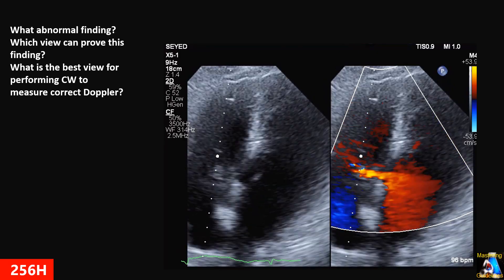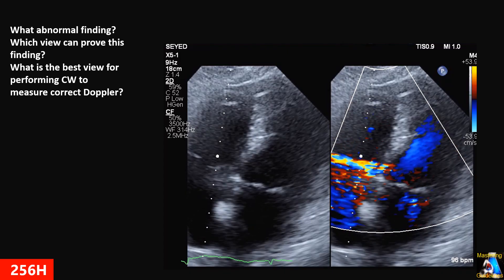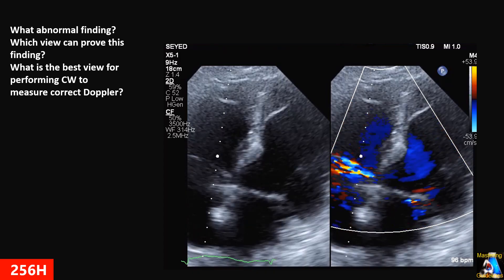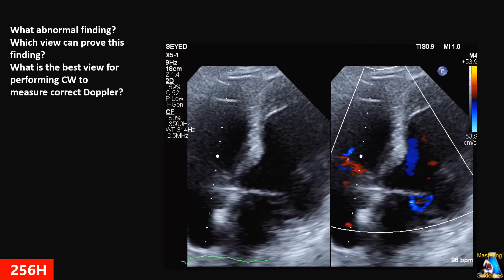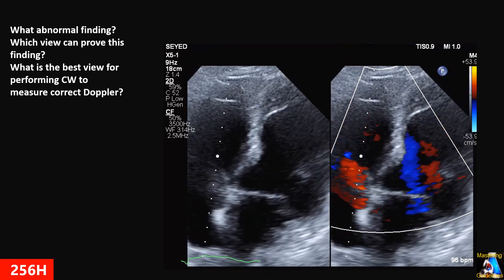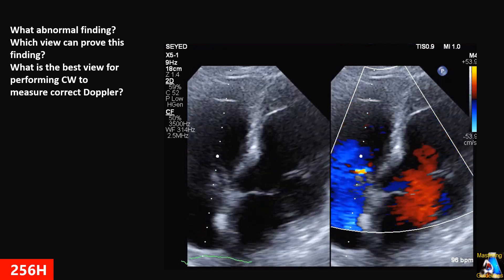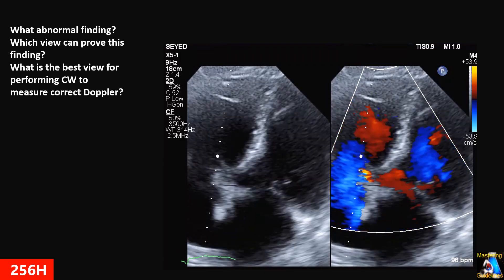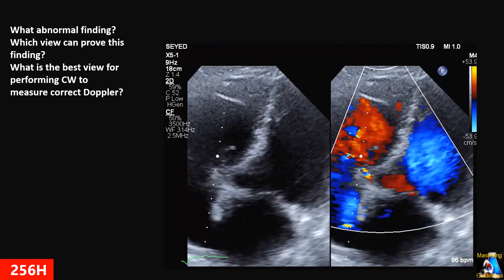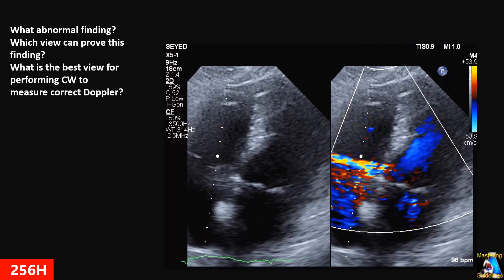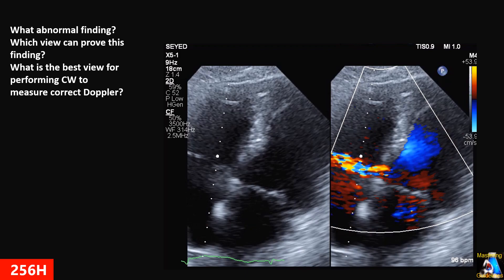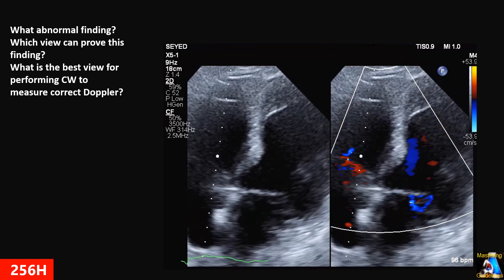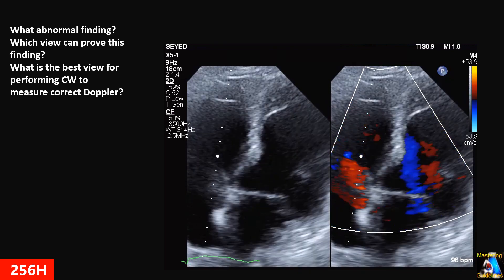Here we have an off-axis four-chamber view and we can see a jet there. What is the jet most probably? How can we get Doppler on that jet and for accurate measurement? What view is the best? And how can we confirm our diagnosis — which view is the best for confirming diagnosis based on this finding on color?